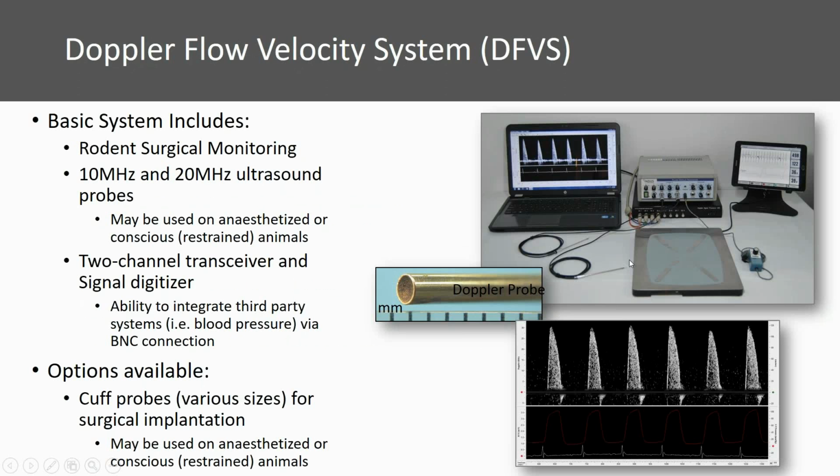We also discussed previously that both the non-invasive probes and the silicone cuff probes may be used to obtain Doppler spectrums on either anesthetized or conscious animals.